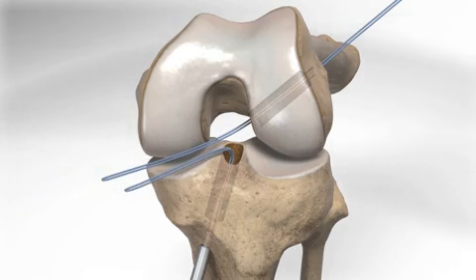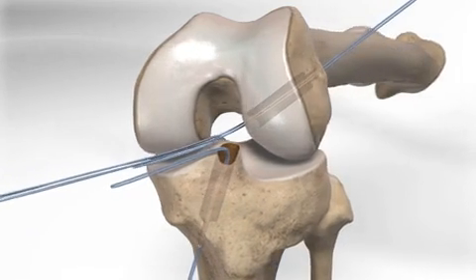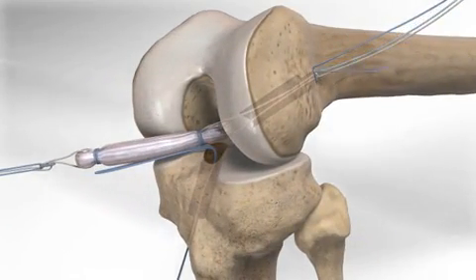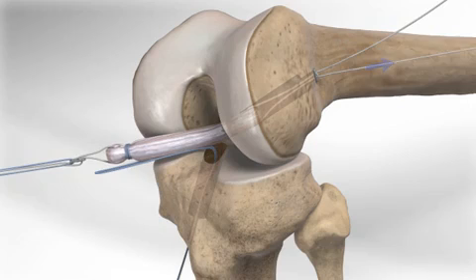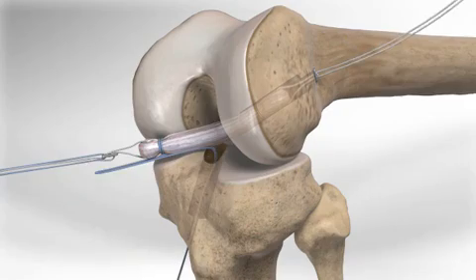The femoral suture is then used to pass the GraftLink construct, which consists of 2 tightrope implants and a single graft sewn into a loop or link. The femoral tightrope implant is passed until the button exits the bone and is fixated against the femur. The surgeon then pulls the white sutures, which hoists the graft into the femoral socket for an exact fit.